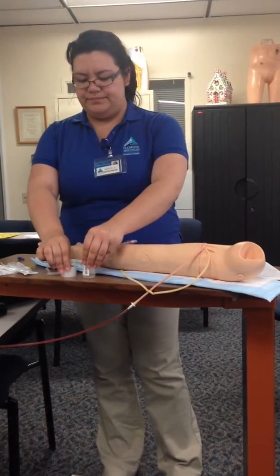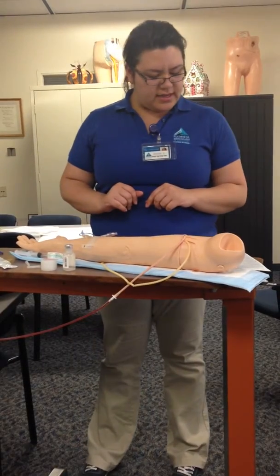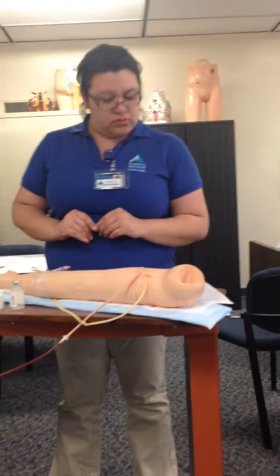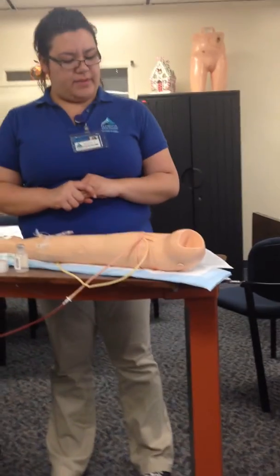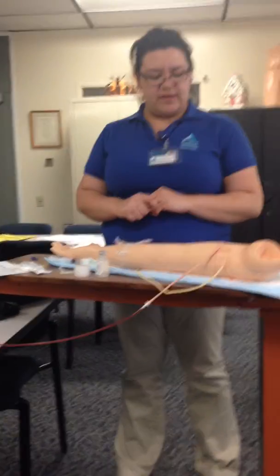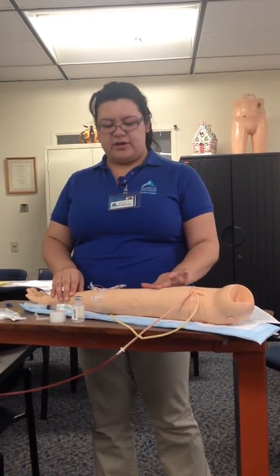I have all my items together. I'm going to identify the client. I'm going to explain the procedure that the doctor has ordered an IV med via the mini bag. I'm going to double check with the patient their name.